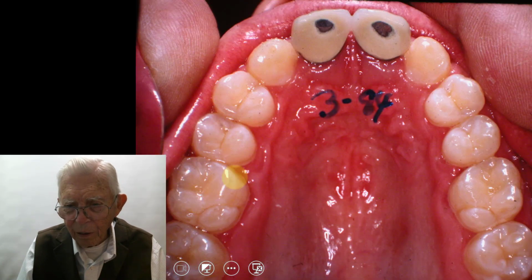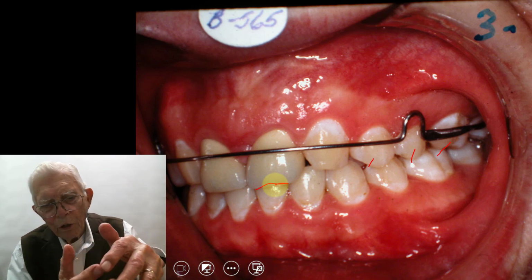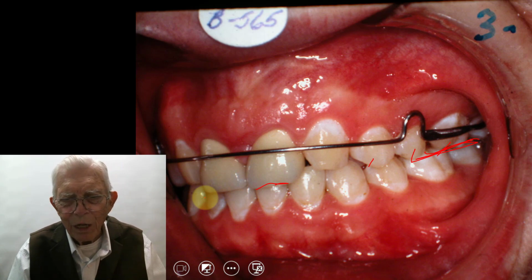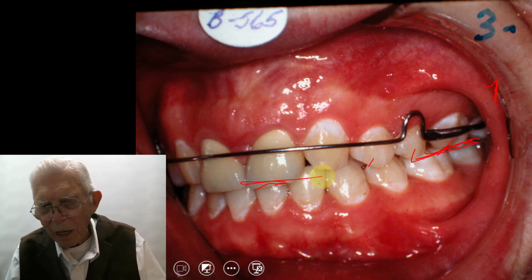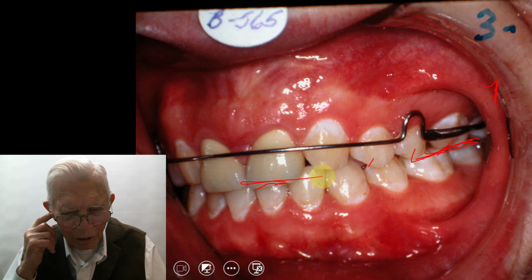And the overjet, let me see if I can get that in there. All right, we've got enough overjet and overbite so that when he moves his jaw out to bite something, he'll relieve these, and these teeth don't touch when you're biting with your front teeth, and all the pressure now is back on the jaw joint and the front teeth. So you can't bite too hard over there unless it's a desperate situation. But you can bite things off. But it's not good to be biting real hard. That puts a lot of load on your joints over here.